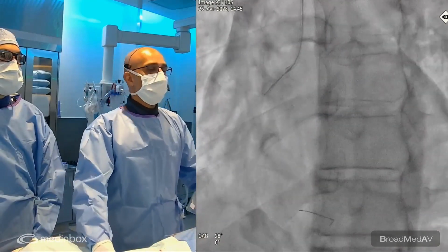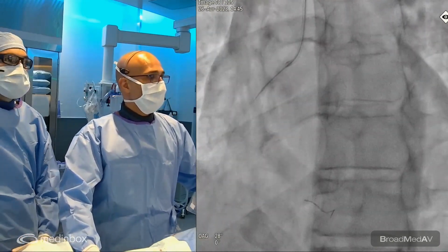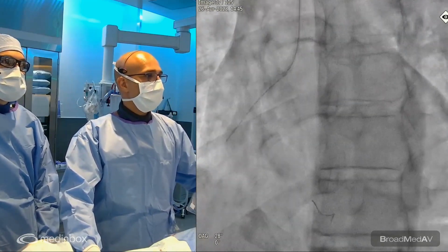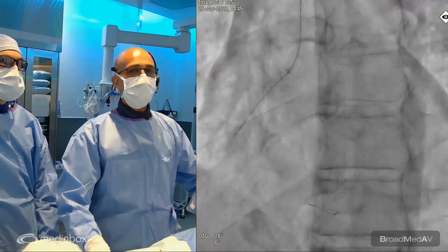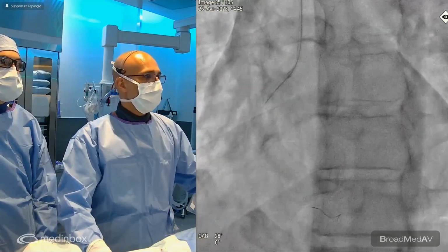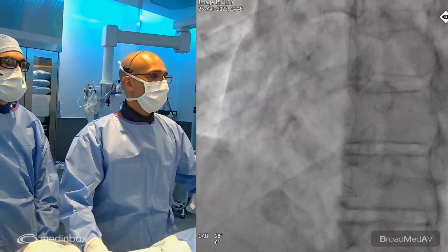As you know, orbital atherectomy uses a 1.25 millimeter burr, and the sanding occurs antegradely and retrogradely, and the burr is mounted eccentrically, so you get more contact with that deep calcium. It went through easily. I had some resistance in the mid lesion of the RCA, but it still crossed. Following the atherectomy, we exchanged the wire for the workhorse wire, so as not to cause distal dissections.